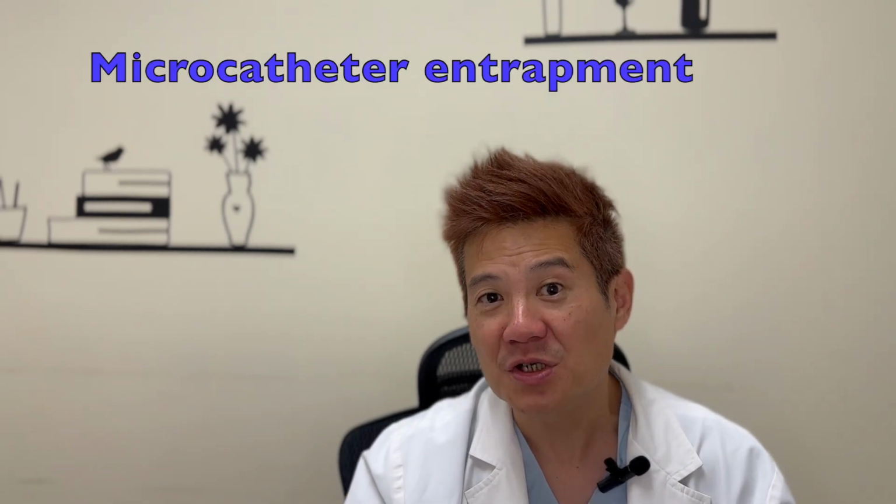Now, microcatheters, again, are uniquely a CTO intervention issue when they get stuck on the coronary wire, because usually the only time we need to drill a microcatheter through a lesion is when there's a CTO. And if we drill too hard, sometimes there's fusion of the microcatheter tip to the coronary wire, and this can lead to equipment getting stuck, especially when we're doing retrograde.